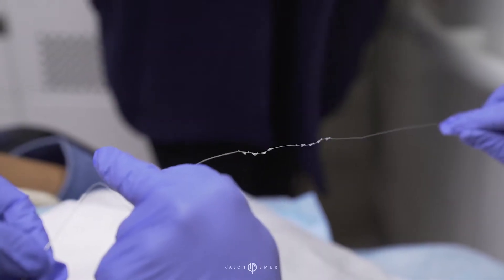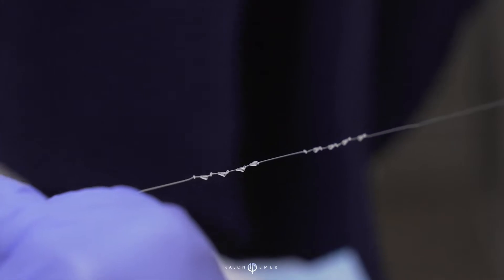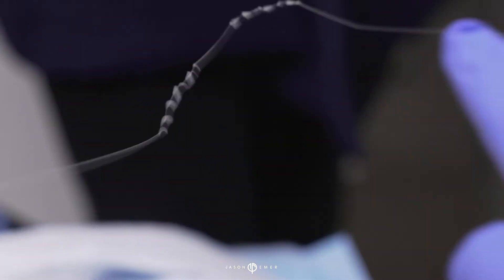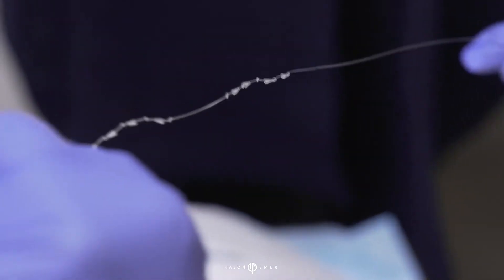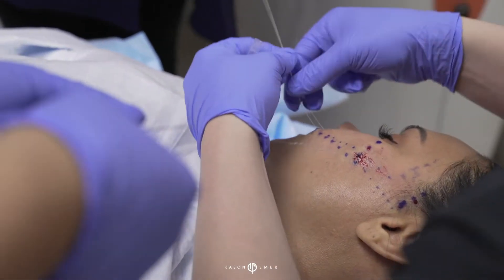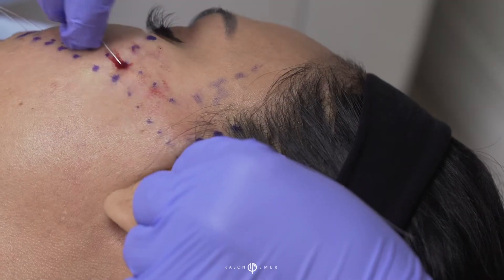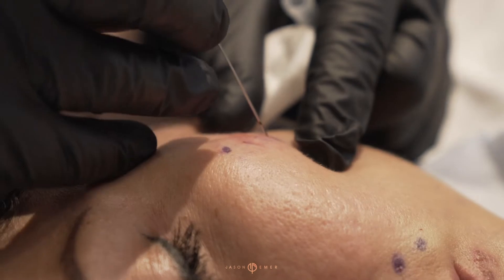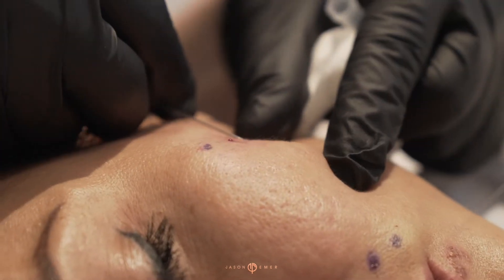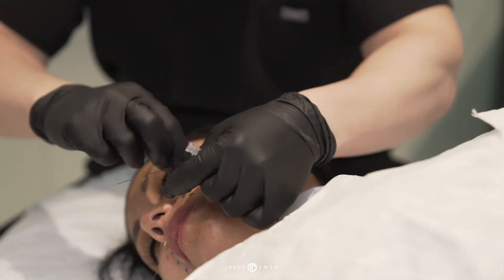If you take a look here, this is a suture that has little baby cones on them. It's called bi-directional because if you see on the left side, the cones are facing one direction, and on the other side, the cones are facing the other direction. There's a little space in between — that's the anchor point, that's this little dot right here. These threads go under the skin and then anchor right in the middle to hold that skin up, and it gives me a lot of variability in actually creating a vector.